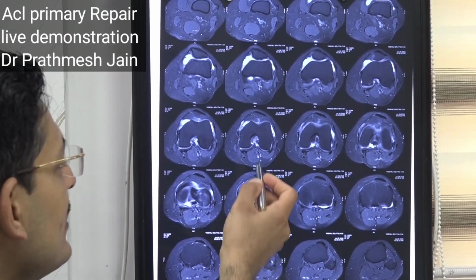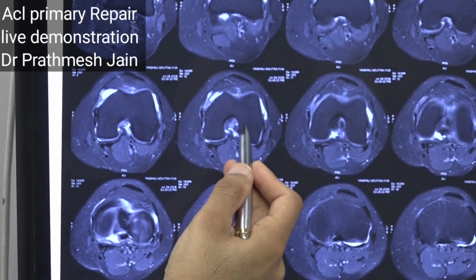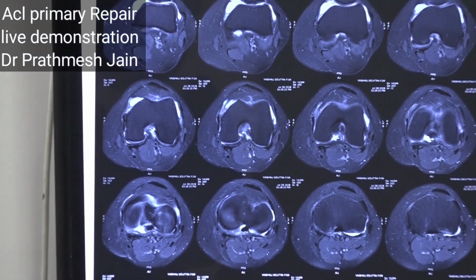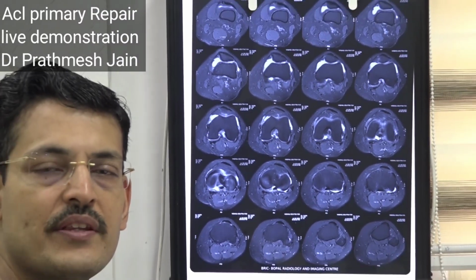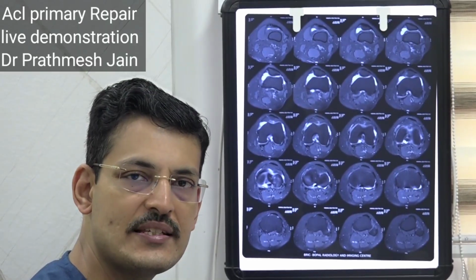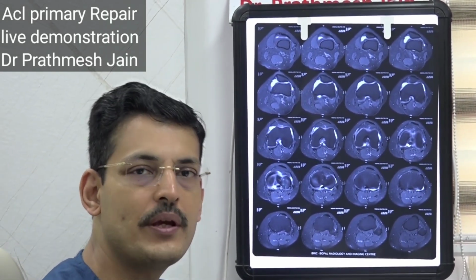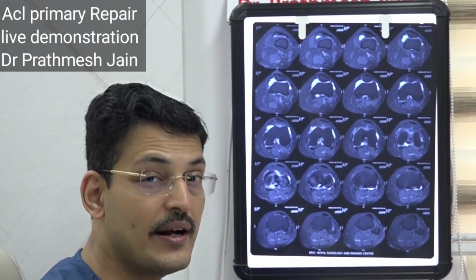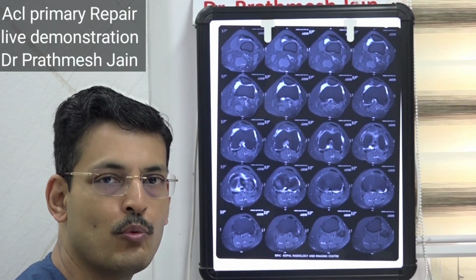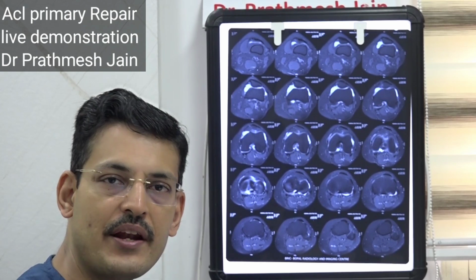And you can see that there is an avulsion kind of injury onto the posterior part of the femoral condyle. So basically this is a type 1 Sherman injury in which there is very little stump on the femur and the whole of the ACL is avulsed from the femoral side, and these kinds of injuries can now be repaired with a very good result, because we can reassure more proprioception and more natural healing to these patients as compared to an ACL reconstruction surgery.